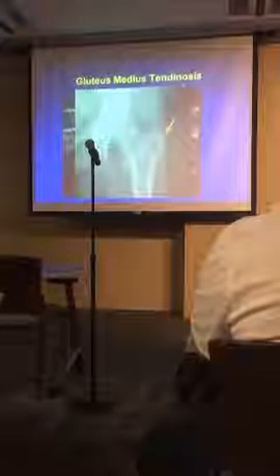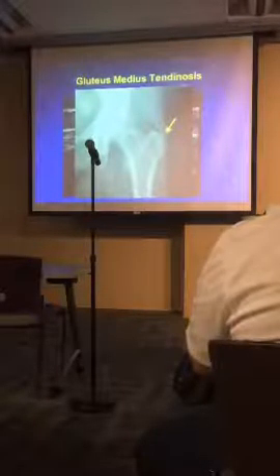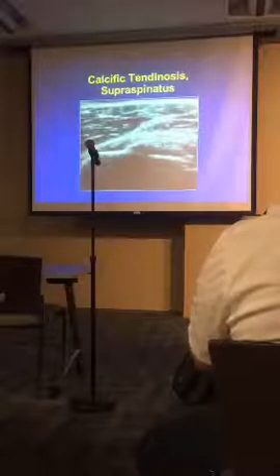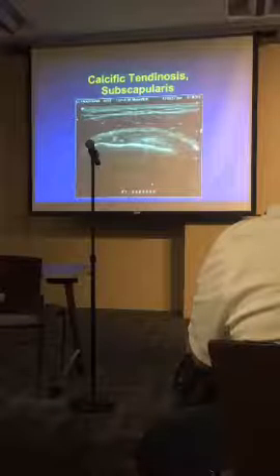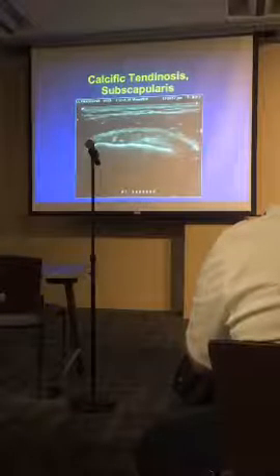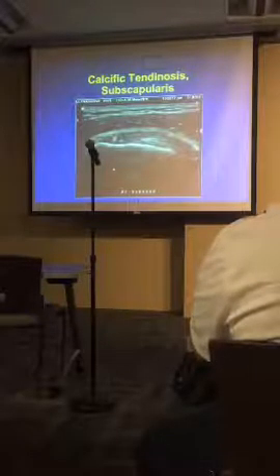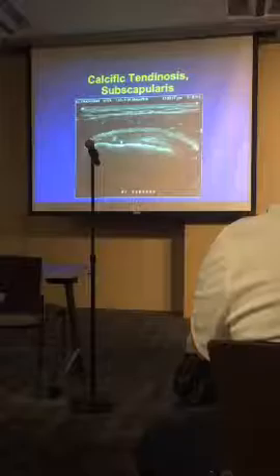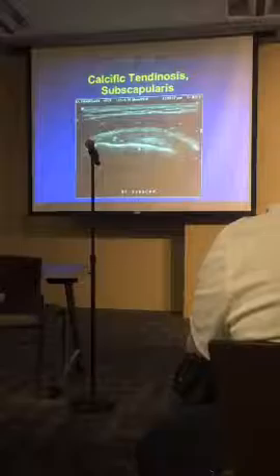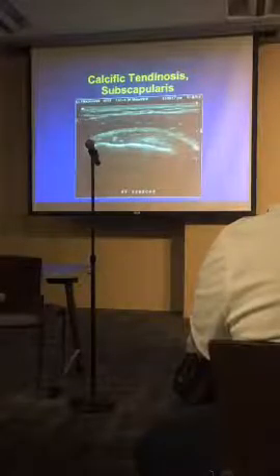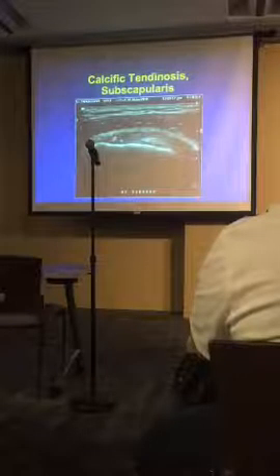The same finding — calcification with acoustic shadowing — is seen in the supraspinatus. However, if a calcification is soft or very small, it may not shadow. For example, in someone with calcific tendinosis in the subscapularis, tiny bits and pieces may show no shadowing at all. So if you see shadowing, it's calcification; but don't rule out calcification just because you don't see a shadow — small or soft calcifications may not shadow.